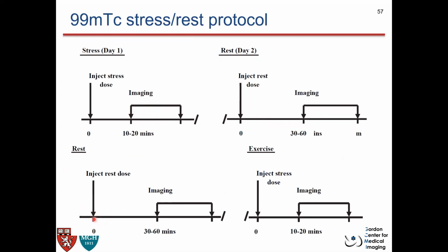And then if you have a single day, you can start with the rest, wait longer for the radiotracer to go through the body, and the patient is ready for imaging for the rest state. And then after that, later on, you inject another dose.